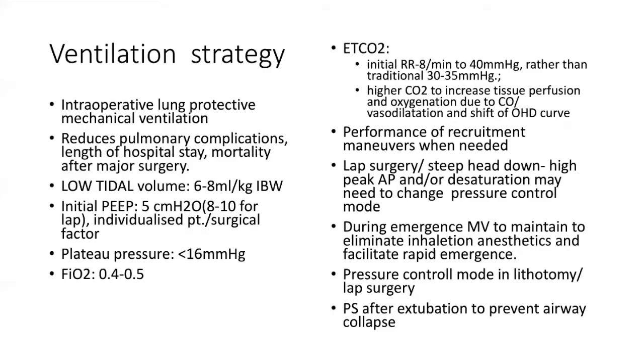With raised EtCO2, there is increased tissue perfusion, as I discussed in the oxyhemoglobin dissociation curve, and there is some vasodilatation, so that may increase tissue perfusion. So we have to do repeated recruitment maneuvers when needed: from the beginning, immediately after intubation, at certain intervals, and also after extubation.